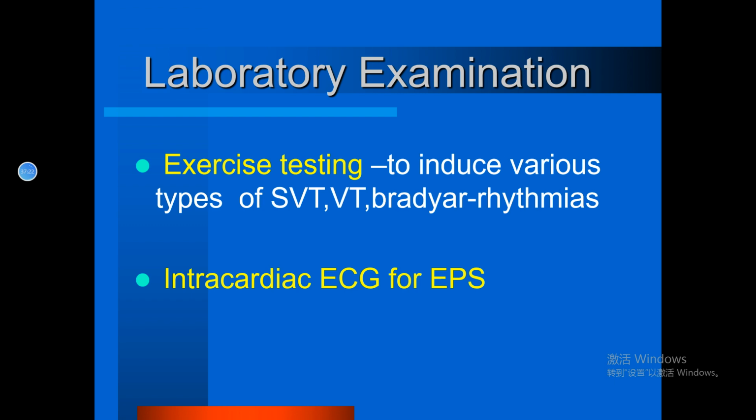And finally, we can use the intracardiac ECG for electrophysiological examination. We advance some electrode leads into the heart, and we do some programmed stimulation to induce the arrhythmia, and then to diagnose it correctly.